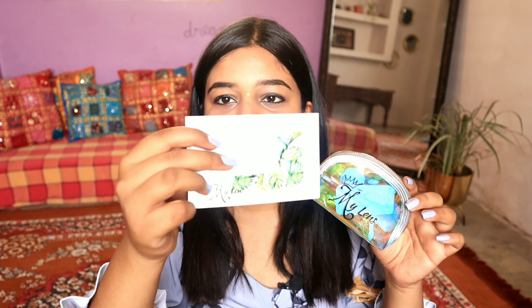When you open the box you get two things inside. First, you get a very pretty purse-type bag, and then you get a note. On one side of the note there is a thank you message, and on the other side you get all the details — how to apply the lens, how to store the lens, how to remove the lens. All the details are written there, so I went through all of them.